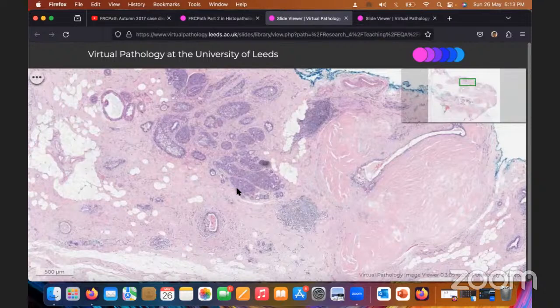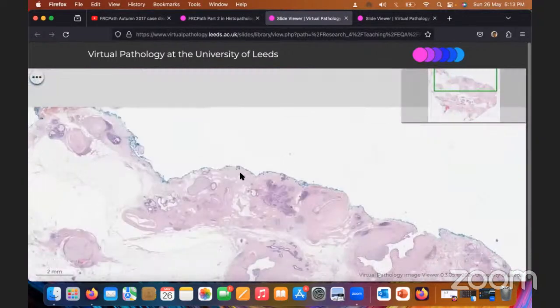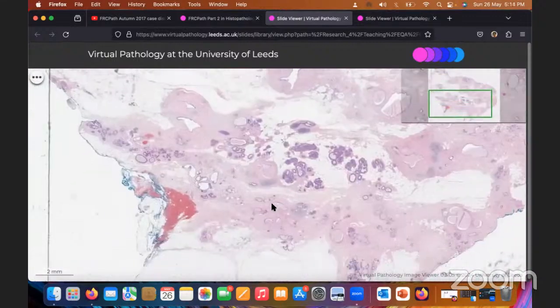So these are the areas, another area of usual hyperplasia and scattered lymphoid aggregates, and a focal element of fibroepithelial lesion is also seen. So this is duct ectasia. There is no evidence of in situ or invasive malignancy. In the further workup, you can say you will evaluate deeper levels and submit every block from the lesion to exclude any possibility of in situ or invasive malignancy. In further information, you can say that this lesion is known to occur in the perimenopausal or in the elderly age group. You can say about the pathophysiology like this.